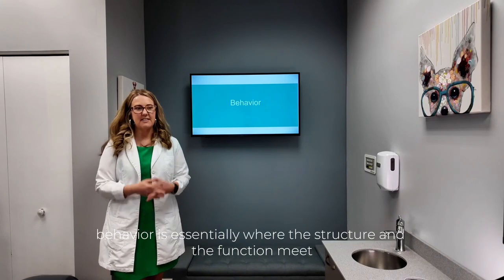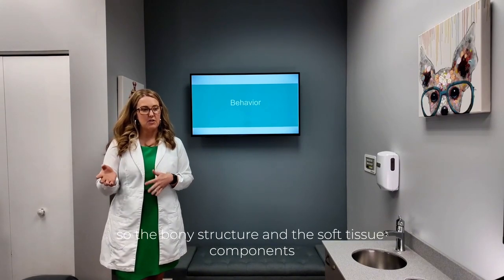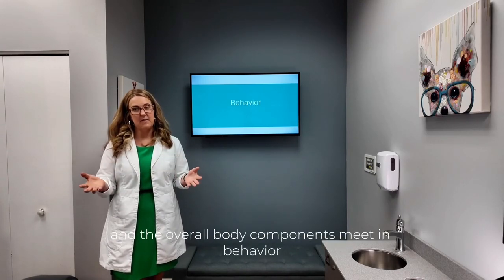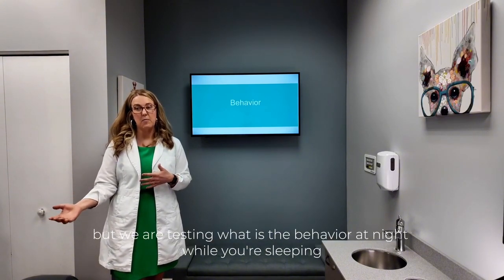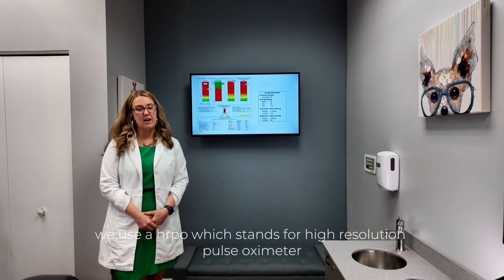Behavior is essentially where the structure and the function meet. So the bony structure and the soft tissue components and the tongue components and the overall body components meet in behavior. Behaviors are something that we see during the day, but we are testing what is the behavior at night while you're sleeping. We use a HRPO, which stands for High Resolution Pulse Oximeter.